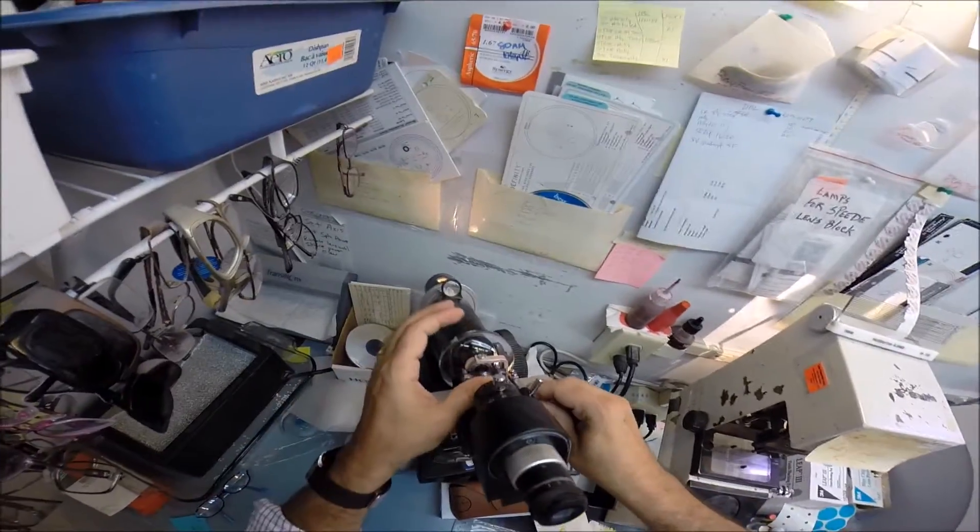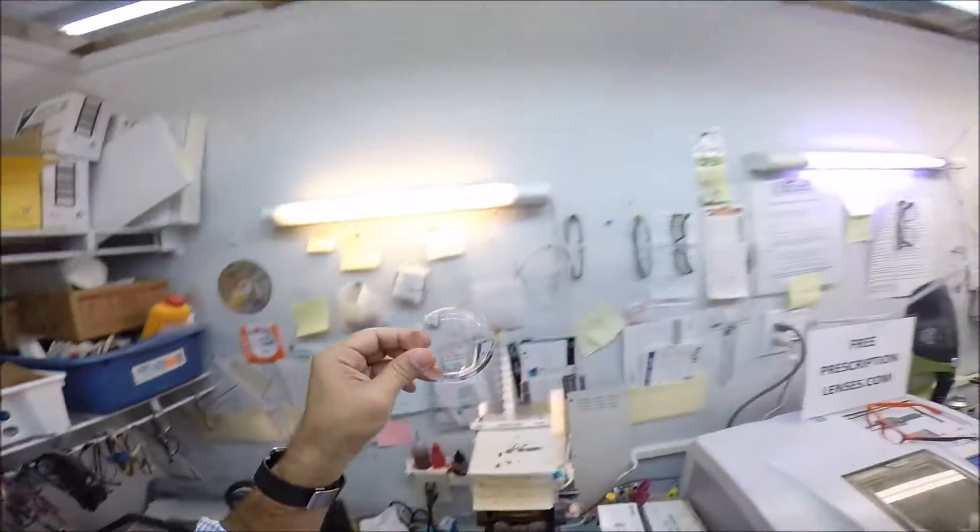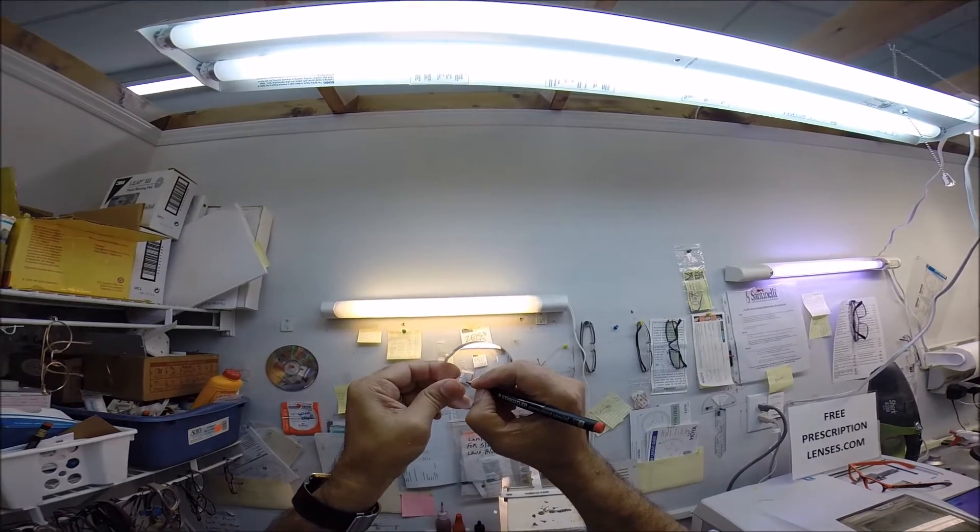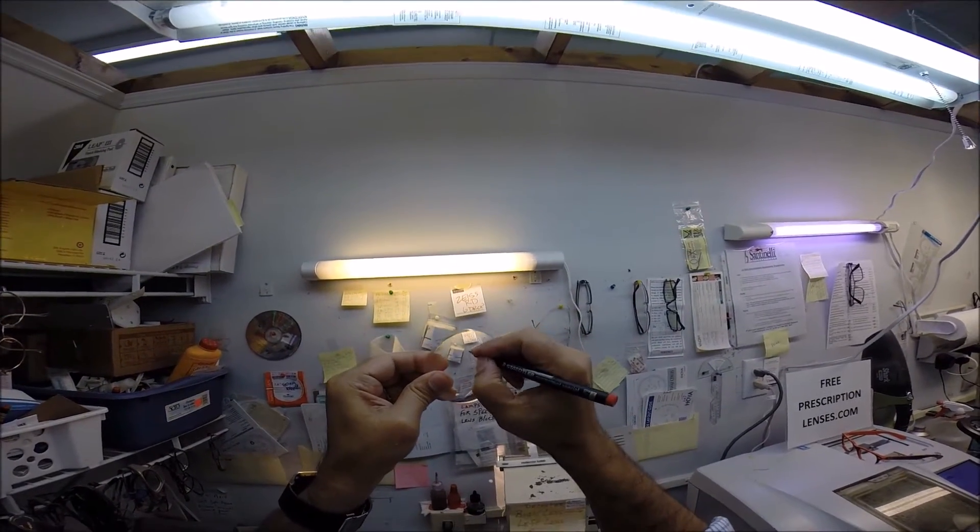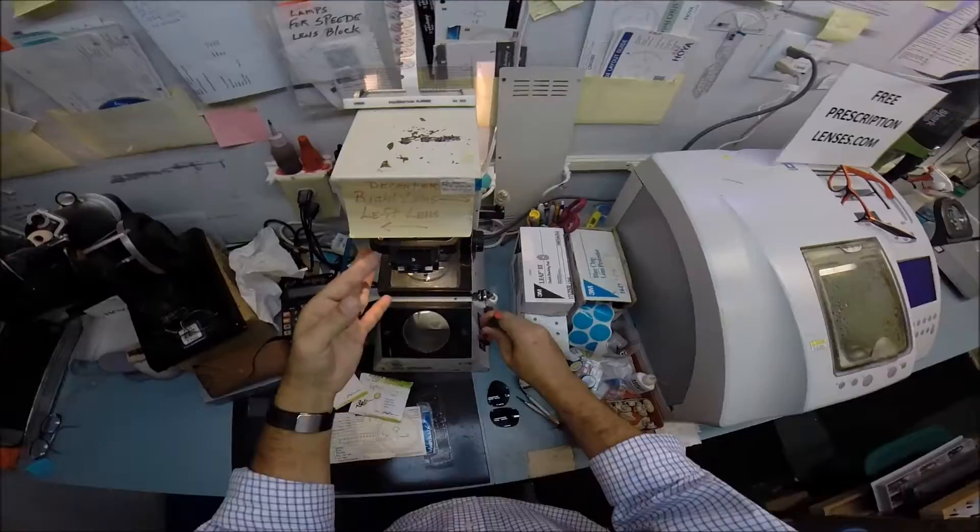It just means you squint. Alright, so I've got three dots on your lenses that you can't see, so I'm going to darken them for you. And this is the right lens, so I'm going to put an R there.